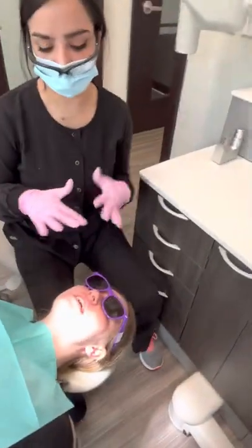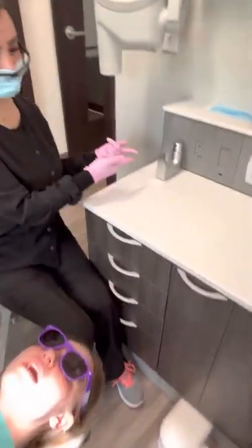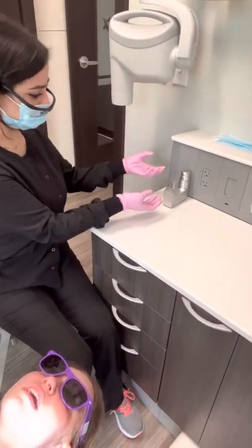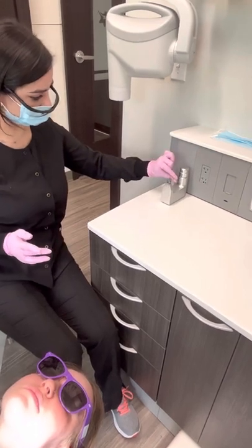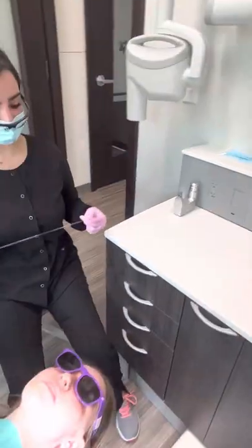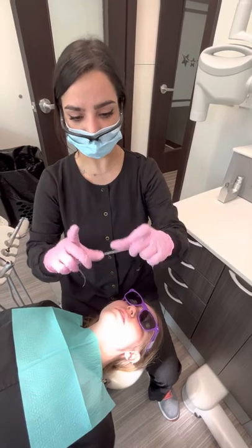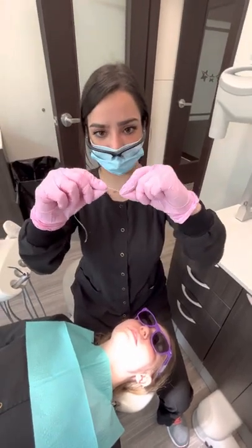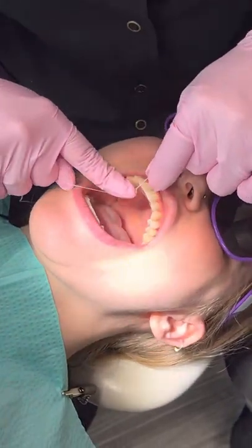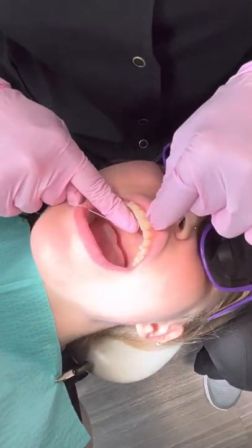Now we're going to go ahead and floss. Because this is not a lap-to-lap exam, I'm going to be using our string floss here. Like I mentioned in the first introduction video, you never want to just grab the floss from the container because you're going to contaminate it. What you do is grab the piece of floss from the center, pull it out, and then push it down. When flossing, you want to put it on your two center fingers — this will allow the index finger and thumb to manipulate between contacts. You're not just popping this in and out; you're going to place it down along the tooth, scratching the tooth on either side.